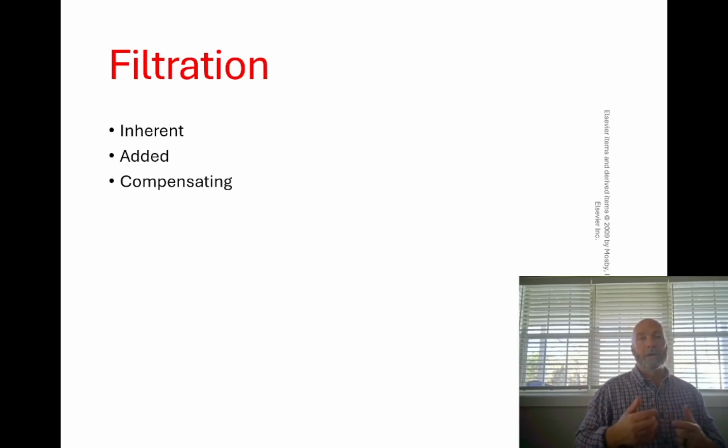So what we're going to have then is these compensating filters that you collimate down and you add the compensating filters as an extra absorber so that the especially low energy X-ray photons don't make it to the breast tissue. So that's a compensating filter.